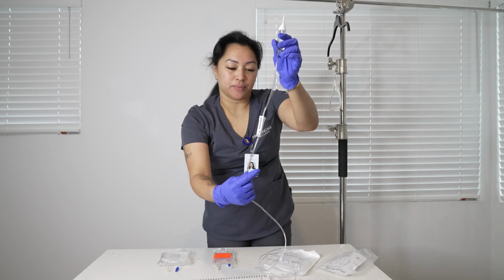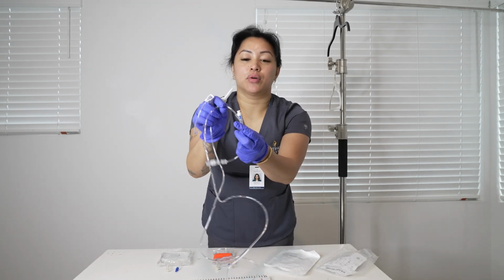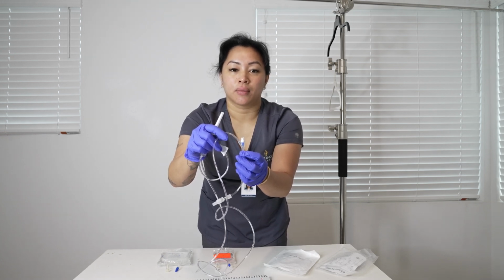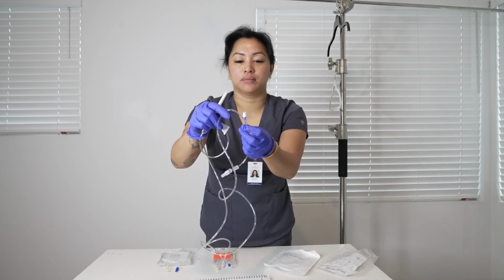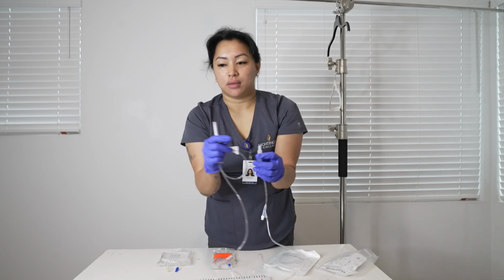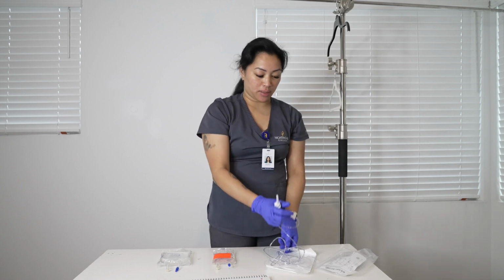In the drip chamber. And then right here is the Y port. This Y port right here is where you can attach the medication, and you can also do an IV push medication onto here. And then this goes into the patient. This is the adapter, and this goes straight to the patient's IV insertion site. Alright, so that is my primary.